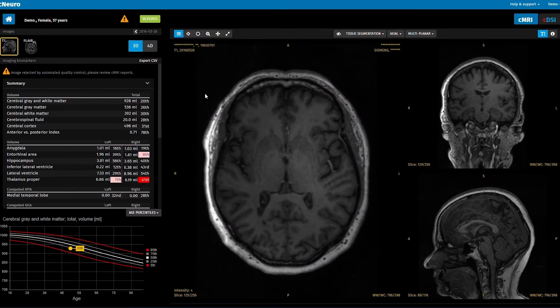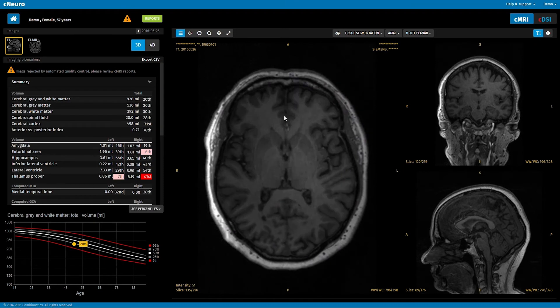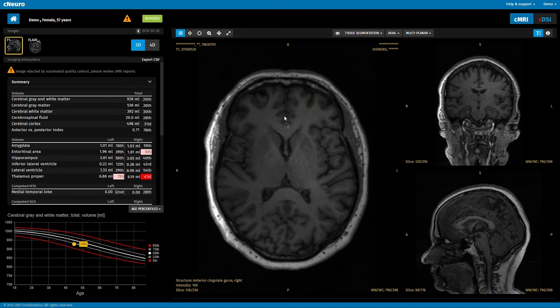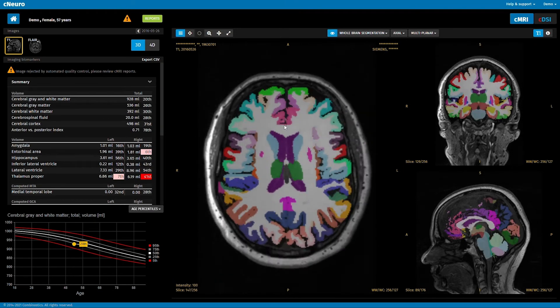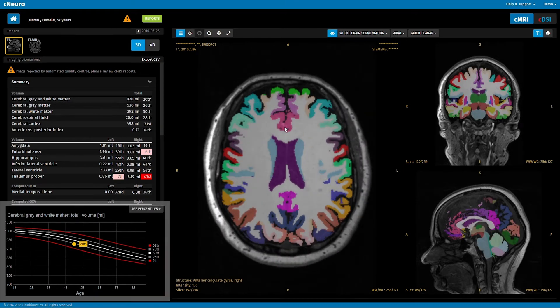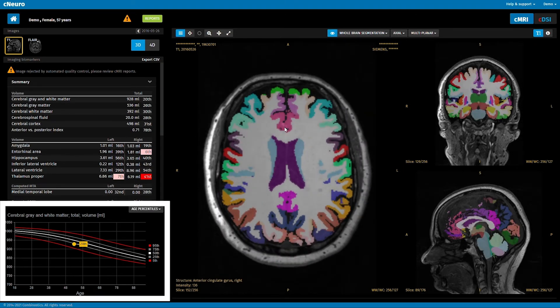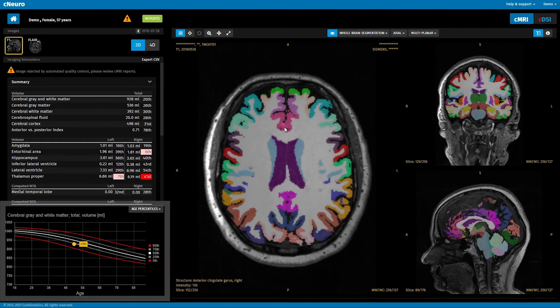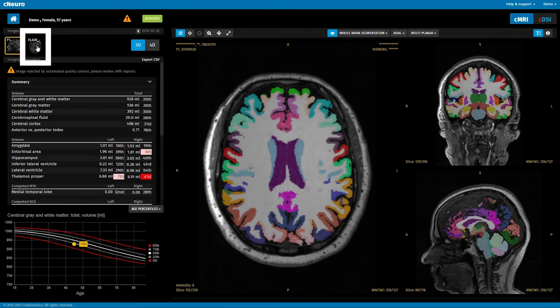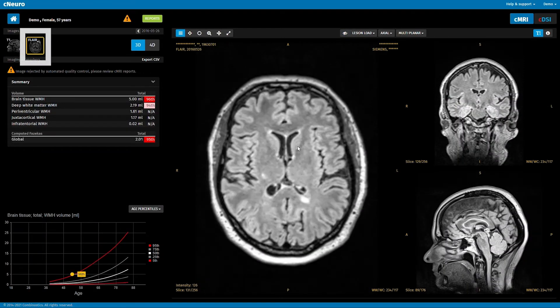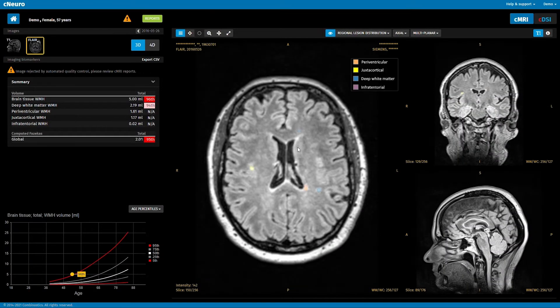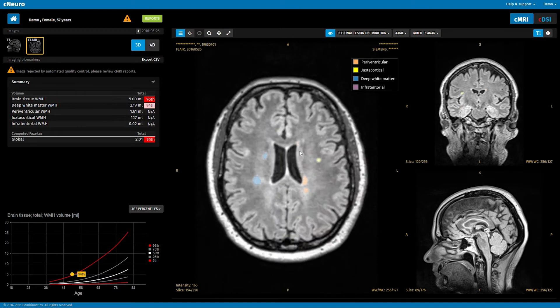For the current scan, you can review segmentations and the computed volumes of brain structures with comparisons to reference data. For FLAIR images, you can review segmentations of lesions in the same way.